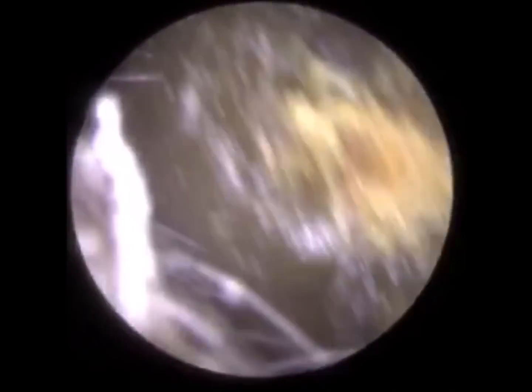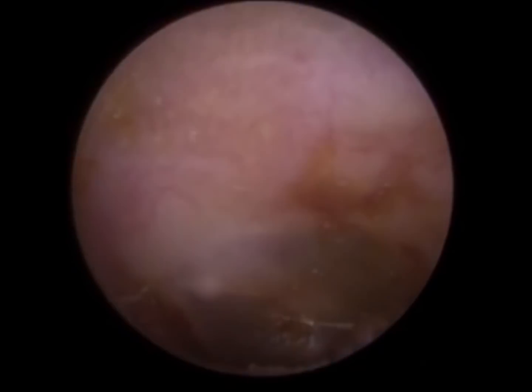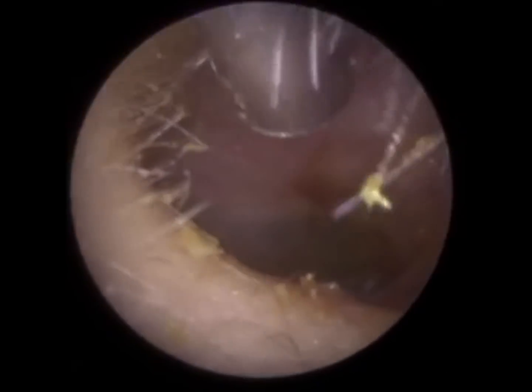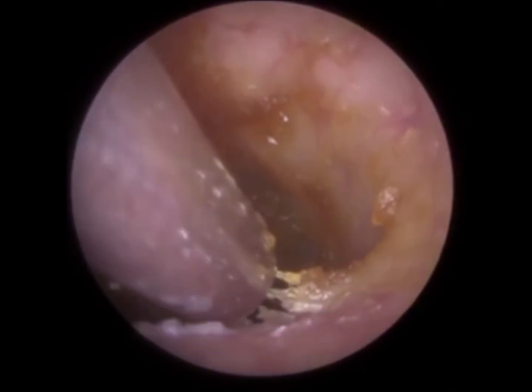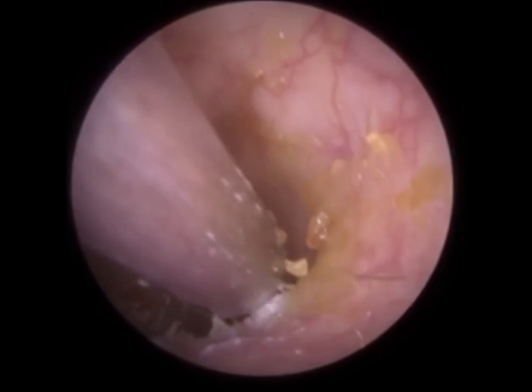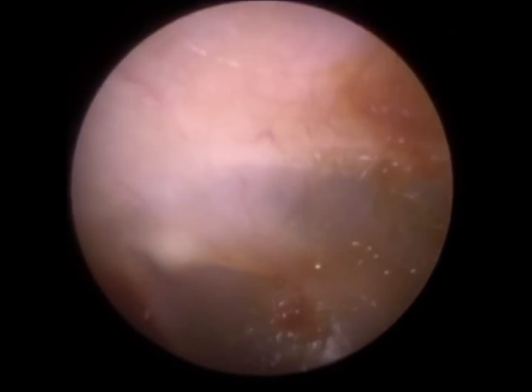You can see there's a bit of hair matted there. It's almost like a cigar shape. You can actually see the curvature on the piece of wax there. I don't know if you saw it, it was a bit twisty, and there's just a bit of residual soft sticky wax at the base of the ear canal near the eardrum, so just slowly suctioning that. It's non-significant really, even if we left it, it wouldn't have caused a problem, but it was quite easy to remove, so anything easy I can go back in.